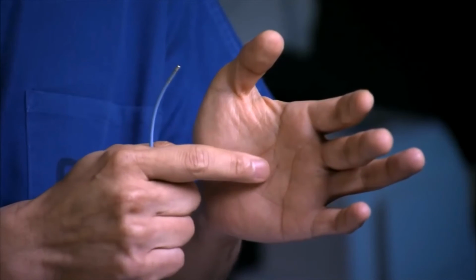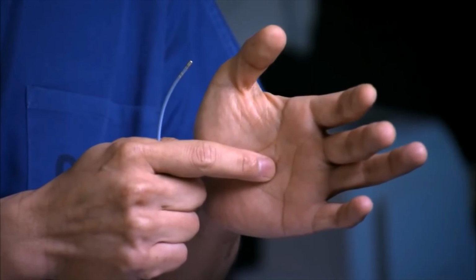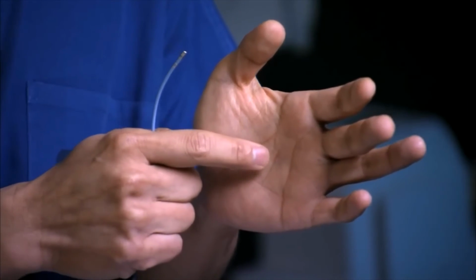And this denatured tissue stops all electrical conduction. And over a few months' time, this denatured tissue then heals itself into some permanent scar. And this is what keeps ventricular tachycardia from reoccurring.